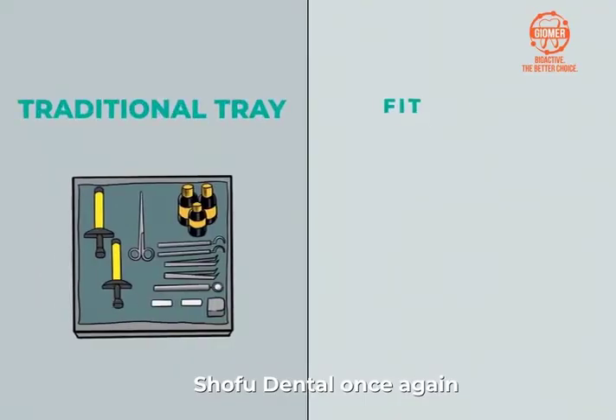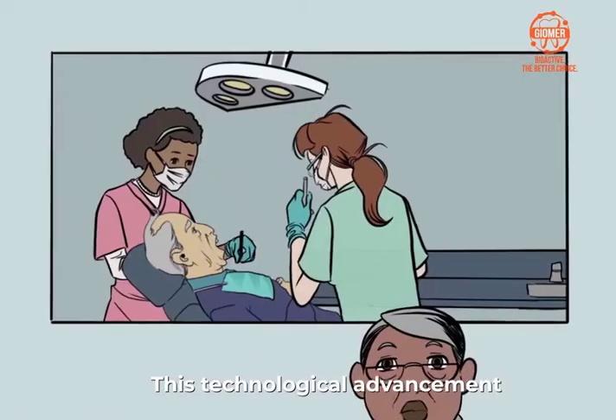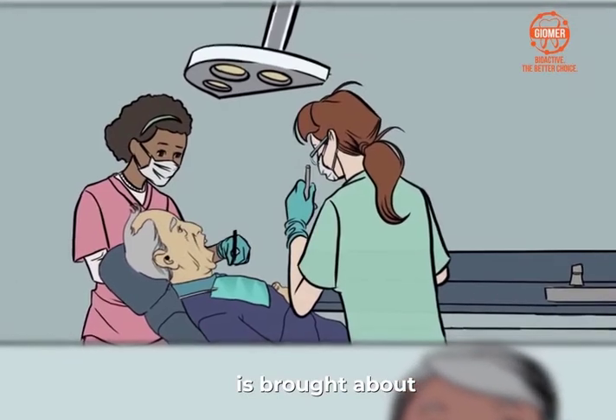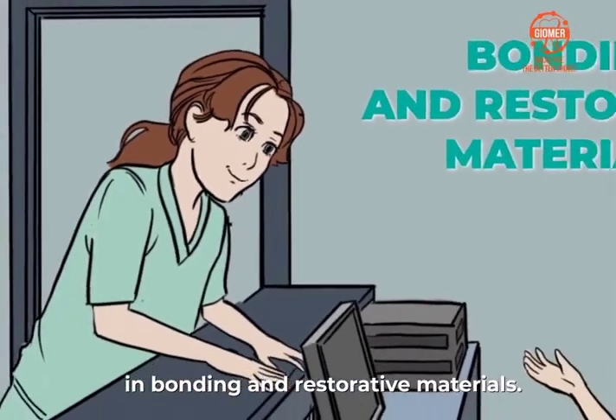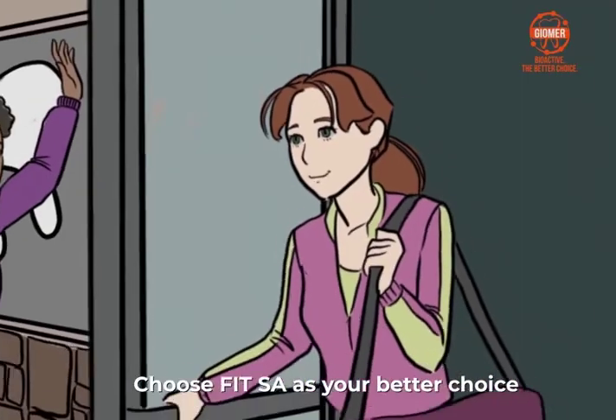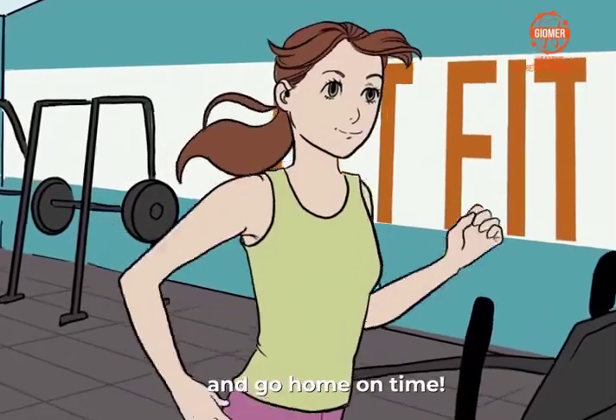Shofu Dental once again sets the standard as the better choice with FitSA. This technological advancement is brought about by decades of proven expertise in bonding and restorative materials. Choose FitSA as your better choice to serve patients, increase production, and go home on time.